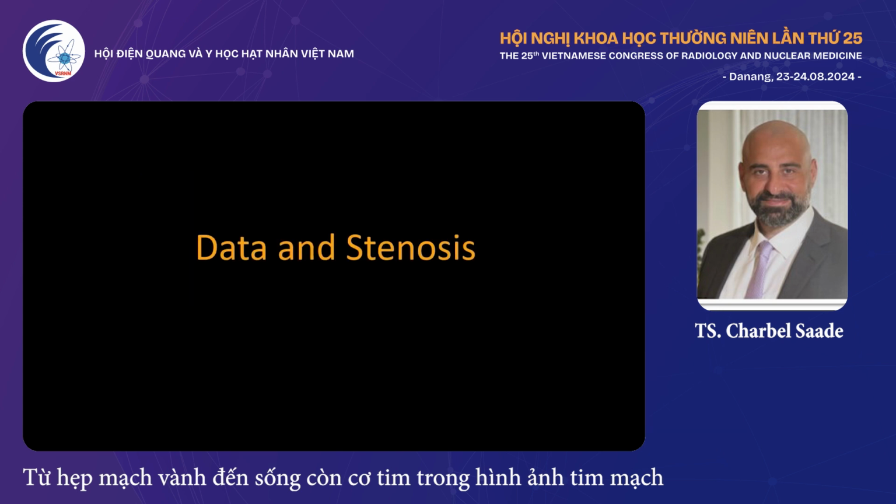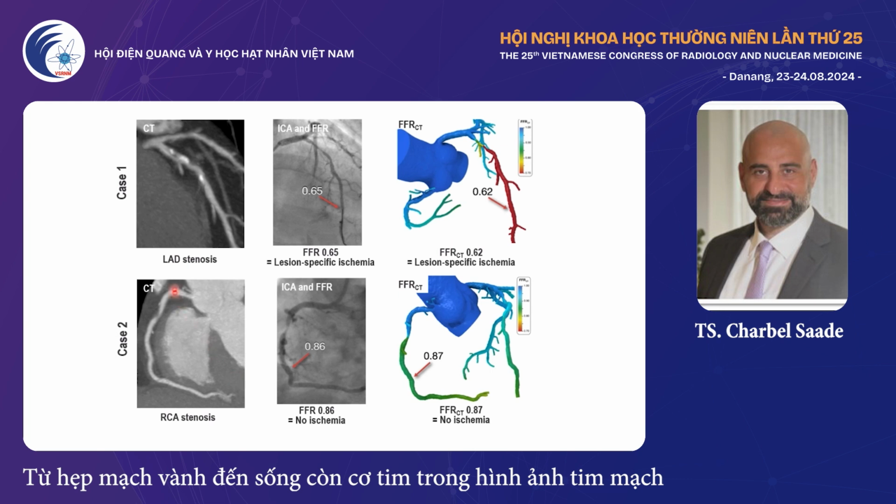Look at data and stenosis. It's not just related to CT. We also need to confirm the impact that the PCI has on the actual outcome of the coronary CT. Look at the first and second cases here.